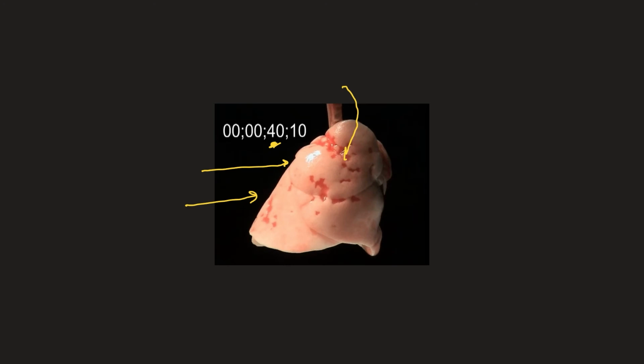And the other way, when you release, when you go into expiration, you also want to cut it short. That way the alveolus doesn't completely collapse. So simply, it makes sense that we inverse the IE ratio. And that's why I want you to use the APRV mode.